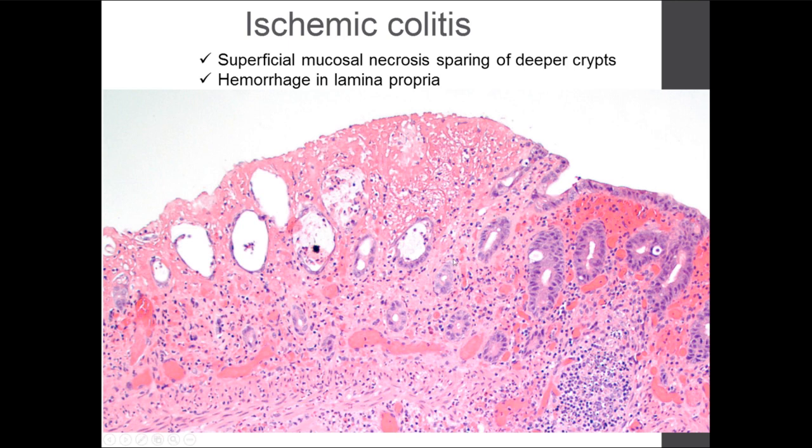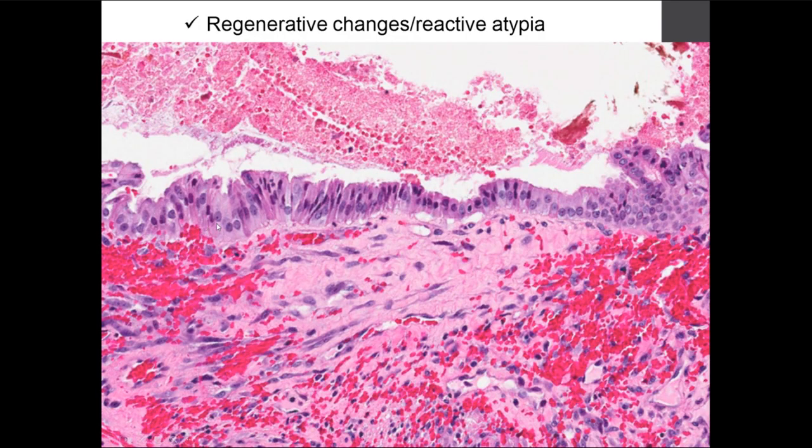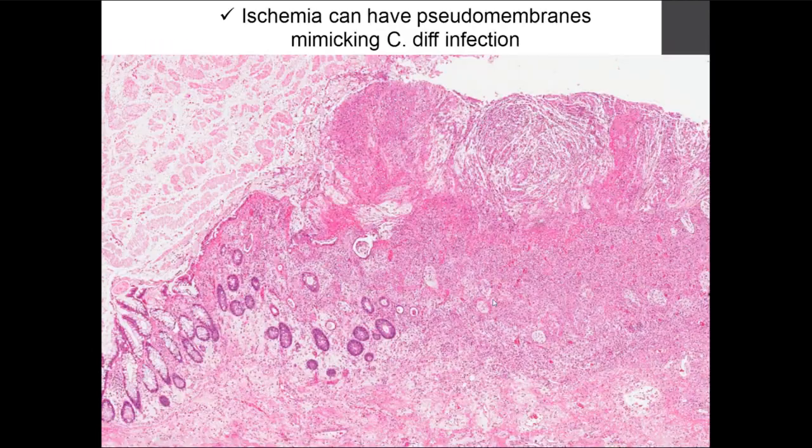The lamina propria, as opposed to the cases of colitis that we saw earlier today, is more pink, hyalinized sometimes, or hemorrhagic. As the patients recover, sometimes we may see some reparative changes that at times may pose the question of dysplasia in the differential diagnosis, because there's marked nuclear hyperchromasia, enlargement, and sometimes even stratification and multiple mitotic figures as part of the reparative process.